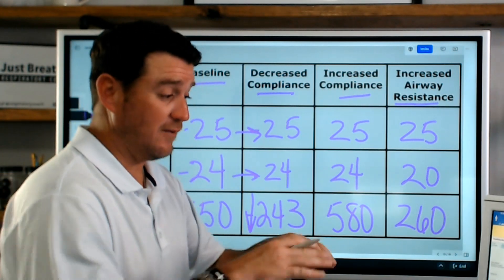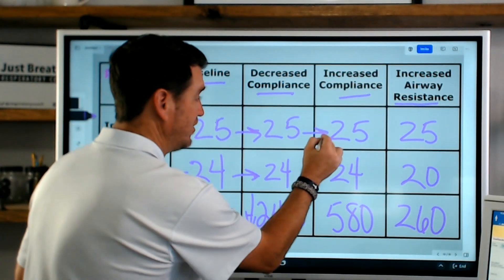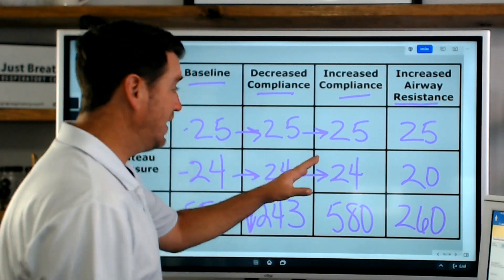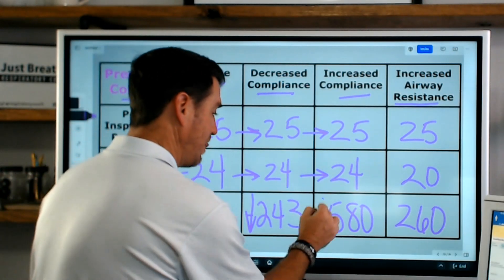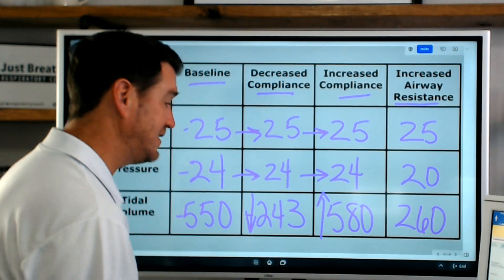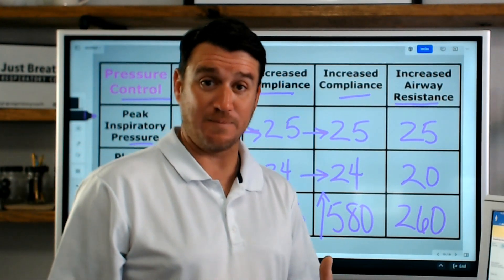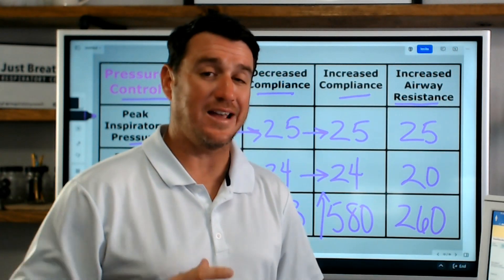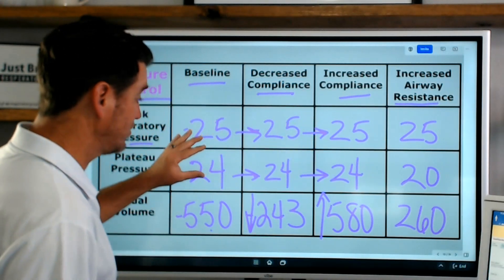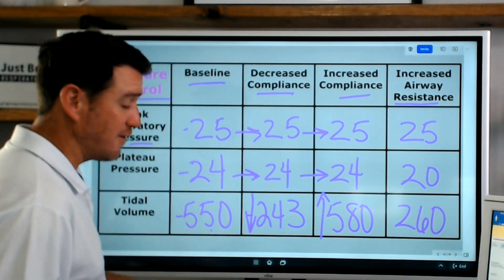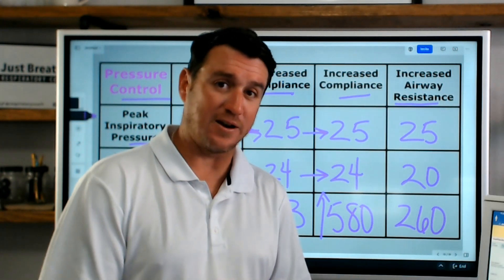Then we took the rubber bands off the test lung and increased compliance. Pressure didn't change - PIP stayed at 25, plateau stayed at 24. But look at our tidal volumes - they actually increased, going up from baseline a little bit. You have to understand what compliance does in pressure control. We're seeing there's no change in our pressures, but there are changes in our volumes. That's the definition of pressure control: set pressure, varying volumes.